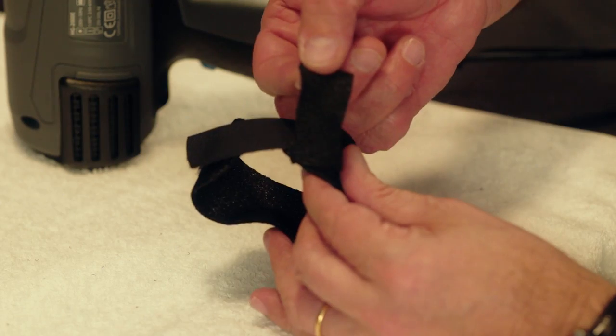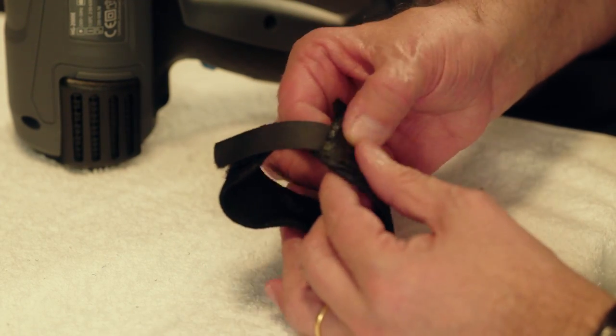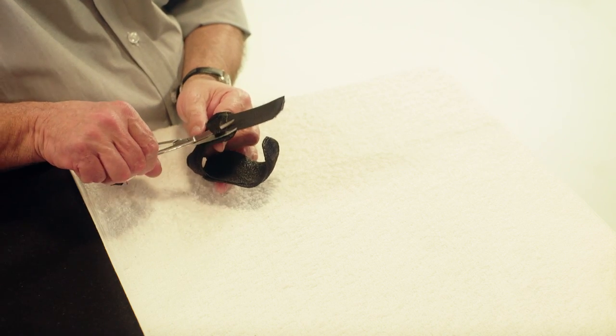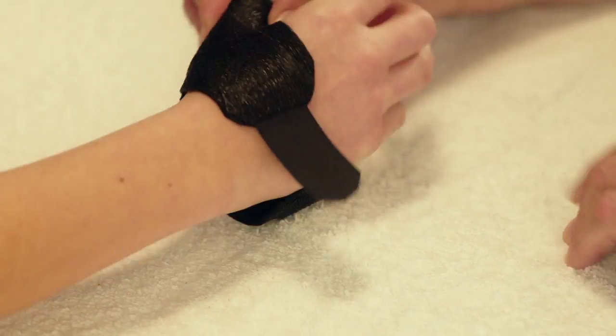Secure the bond of the Velcro loop to the orthosis by applying a piece of dry heated Orphicast on the edge of the Velcro loop. Try the orthosis on the patient and check the fit.